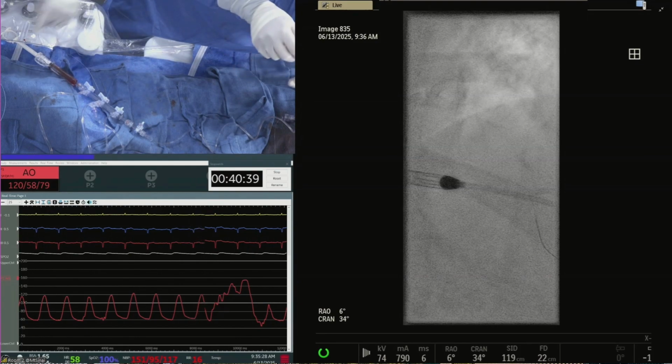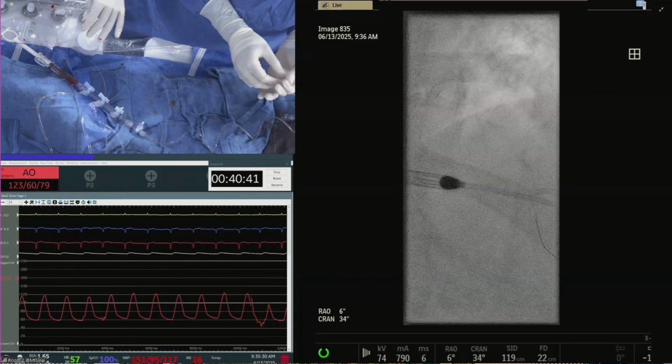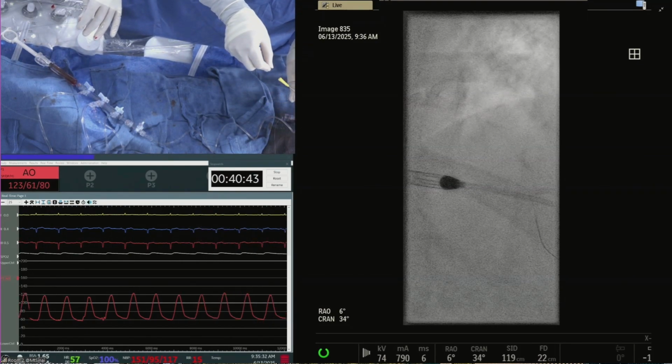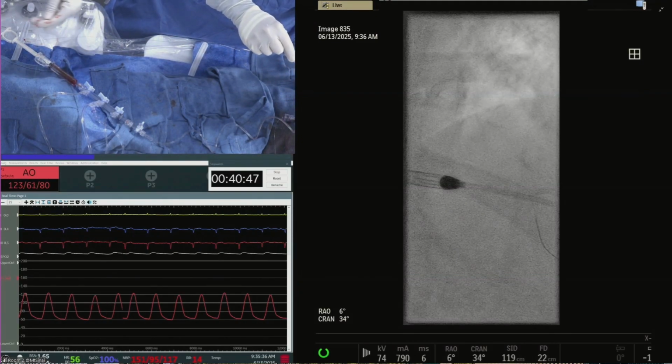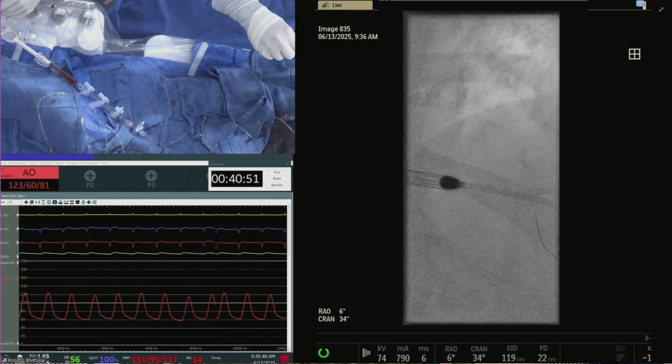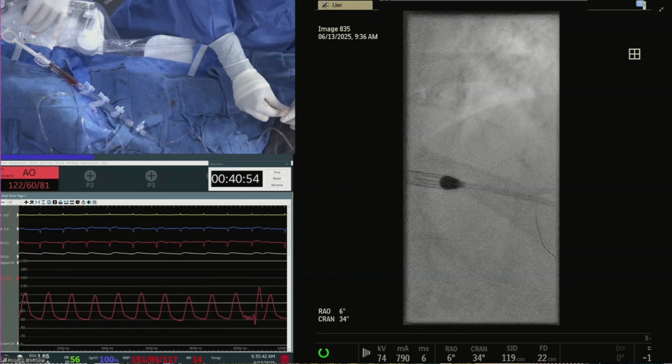Interventionalist's enemy, calcium. So the key is, what you'll not do is even hook it. I think you have to go into the diagonal because it's a rotor wire in the diagonal. Let's dilate at that level, and then change the wire and we see if we can wire the LAD. Keep the Fine Cross ready again for the LAD.